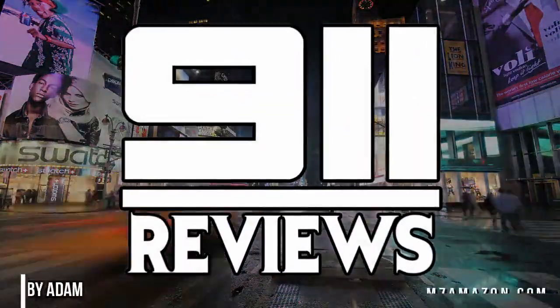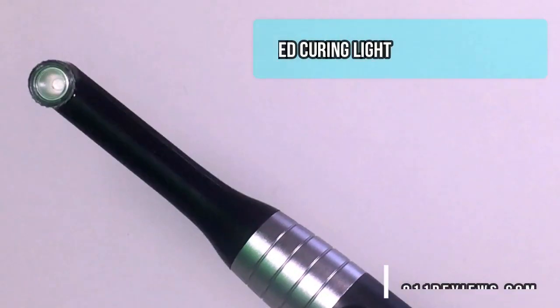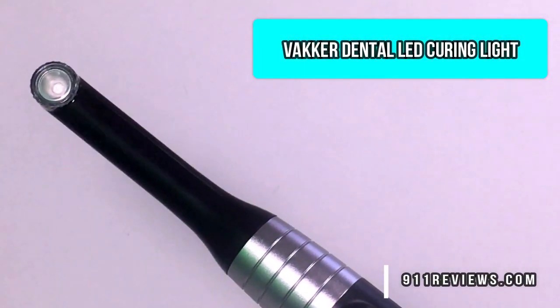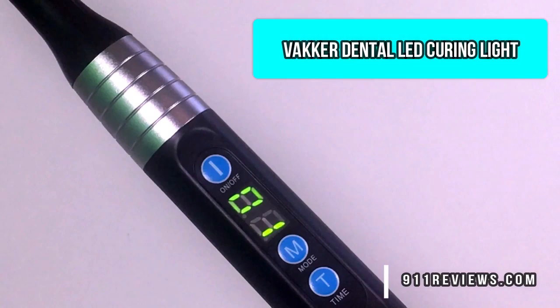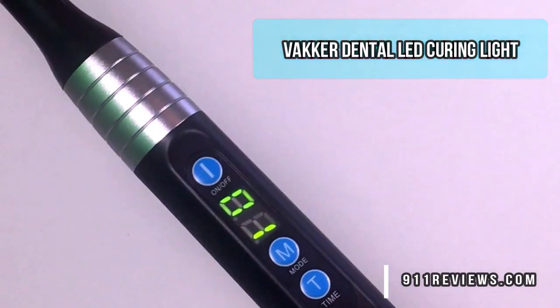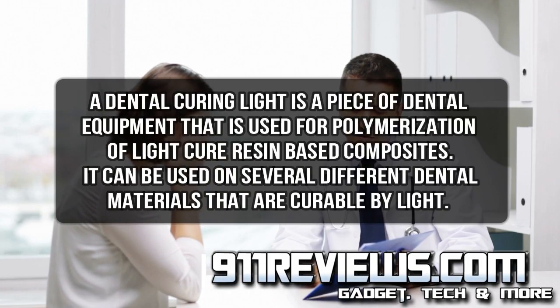Good morning health and tech fans. This is Adam from 9-1-1 Reviews and today we're going to look at a pretty fantastic LED curing light made just for you. This revolutionary LED curing lamp will cure resin in just one second. It's totally rechargeable with a lithium-ion battery. It's easy to use and it comes with 100 protective sleeves for use with various patients.